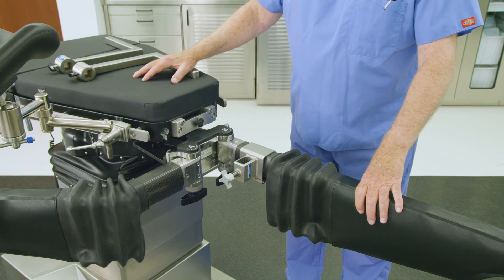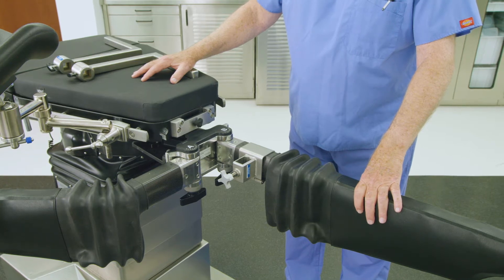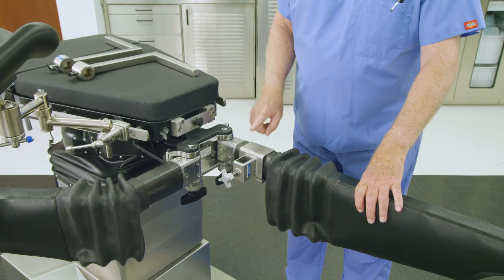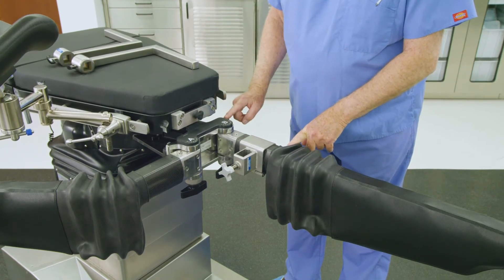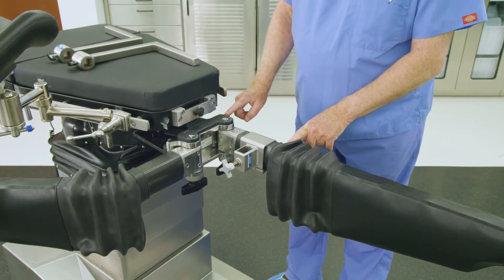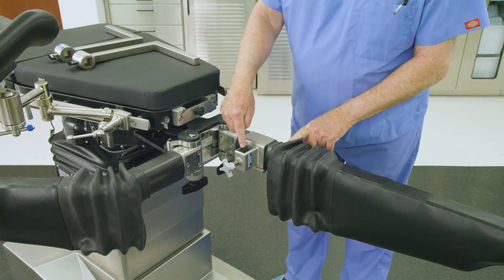To prepare the table appropriately for a tibial orthopedic procedure, start by installing an accessory spar clamp on the short end of the abductor spar of the operative side leg spar as shown. Position the accessory spar clamp so that its hole is on the inside of the spar. Tighten the spar clamp's knob to secure.